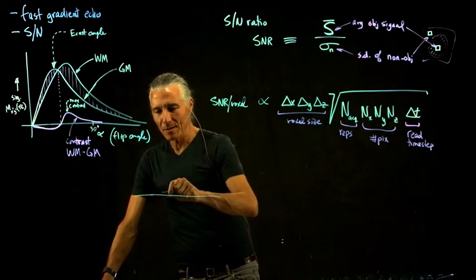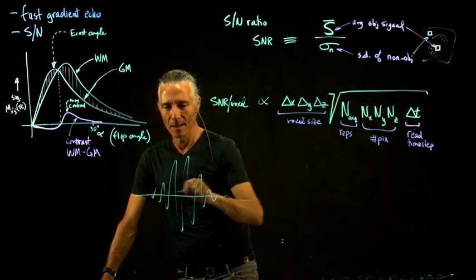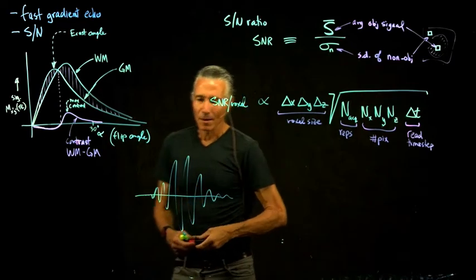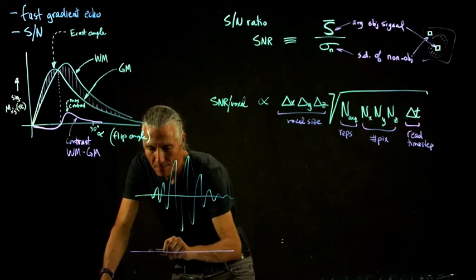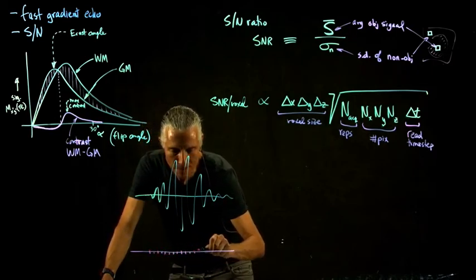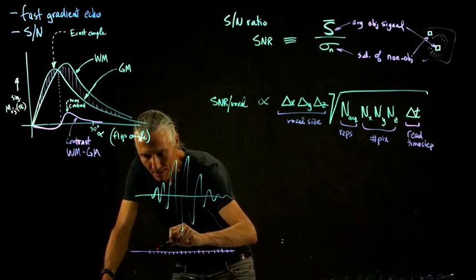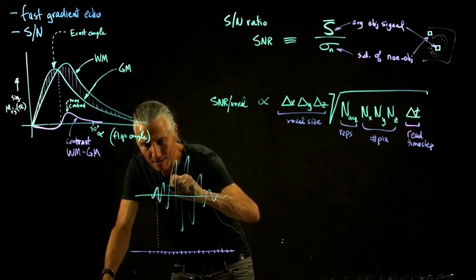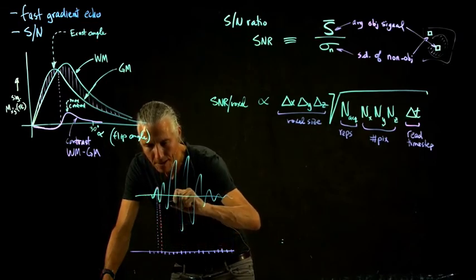Here's our echo coming in. When the echo comes in, we record it, we digitally sample it. We make a whole bunch of samples of that recording. For each sample, we just go up in time to our continuous echo coming in, and we say, I'll take that value. And then I go up there, and I say, I'll take that value.